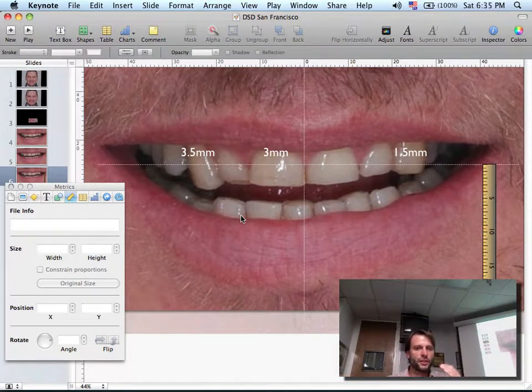For example, usually aesthetically we want to show less lowers and more uppers. So depending on the pictures and on the video, which is very nice, because when the patient is talking and smiling, you can see usually older patients are showing a lot of the lowers. So then we can reshape the long ones and bring them down instead of raising the lower ones. But this decision can be made. Then we will just level that incisal edge of the lowers with the incisal edge of the uppers. So now we have buccal of the uppers, buccal of the lowers, and everything is aligned with the face.